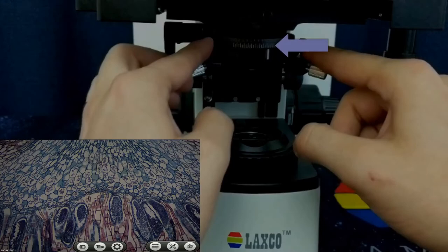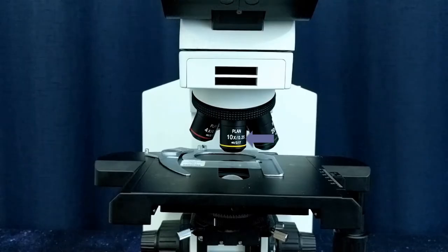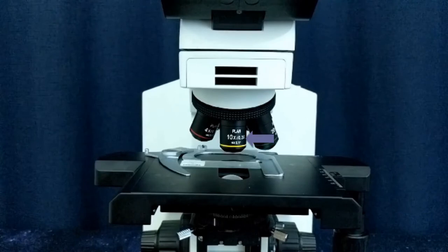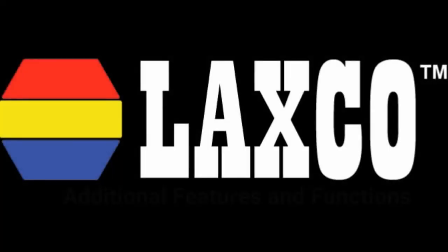Next, open up the condenser diaphragm and match this number to this number on your current objective. This will ensure that there is an appropriate amount of light going to your current objective for the best resolution.